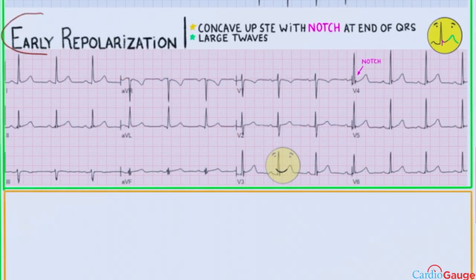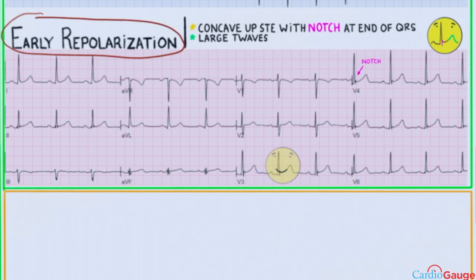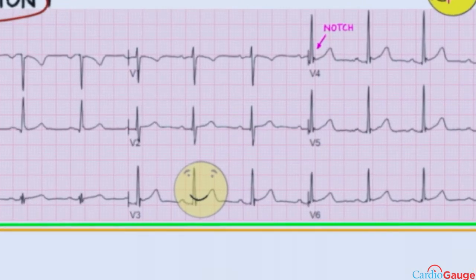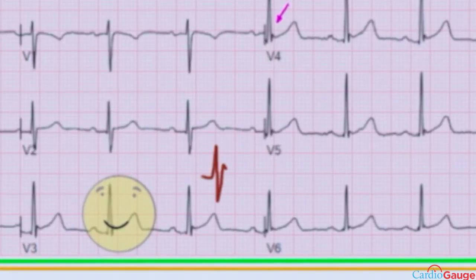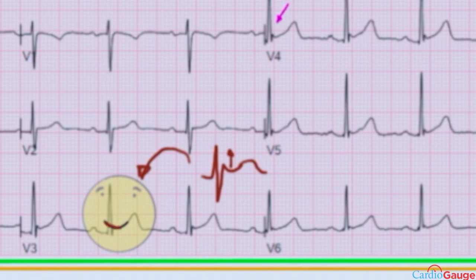Let's go over early repolarization. That's a normal variant — it's common in younger people and athletes. There are three basic things about it on the ECG. There is concave up ST elevation with a notch at the end of the QRS. Concave up means the ST segment looks like a smiley face, with the concave portion facing up. Early repolarization is a normal variant and generally benign.